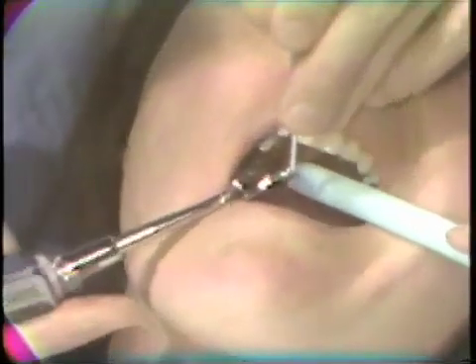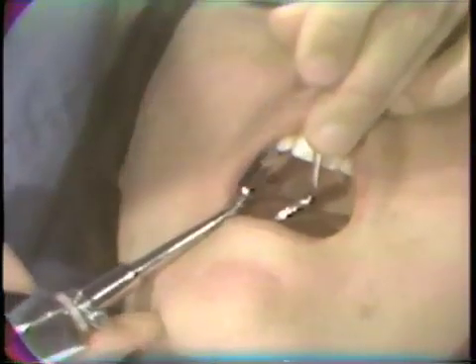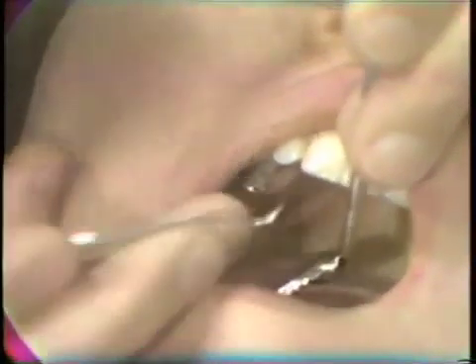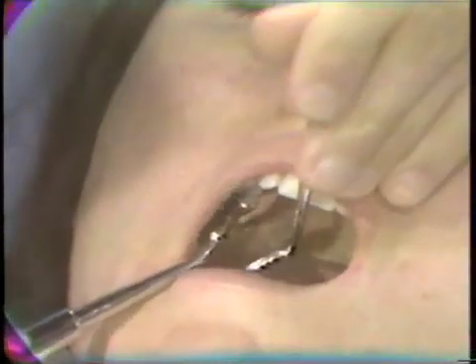The final evaluation for cement removal should be to take the air syringe in one hand and the mirror in the other, and go around the entire cervical area. This deflects the gingival tissue away from the tooth, dries out any residual cement, and makes it thoroughly visible so that it can be completely removed. Going around the entire tooth to be sure that all the cement is removed.